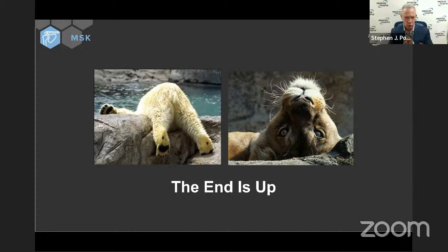The other projection that's useful for the ulnar nerve is the coronal projection. You kind of follow the nerve down to the epicondyle, you lose it, and then you follow it down again. Why do I like that? Because that will help me see if the nerve goes from thin to fat to thin again. So a caliber change is really important. Not so much behind the epicondyle, but if I have a caliber change above the epicondyle or below the epicondyle, I get worried.